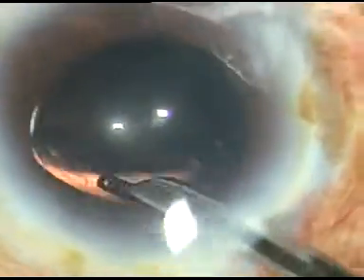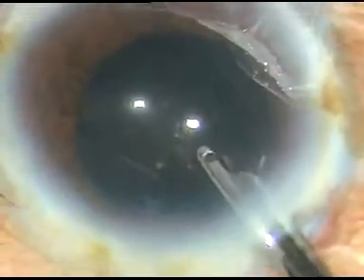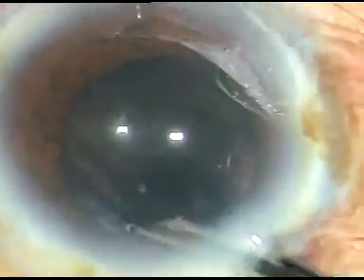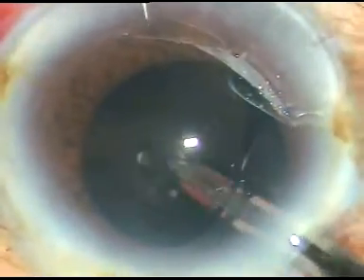First I irrigate out the viscoelastic substance from the anterior chamber using BSS. Then I go behind the intraocular lens and irrigate the capsular bag — the space behind the intraocular lens.